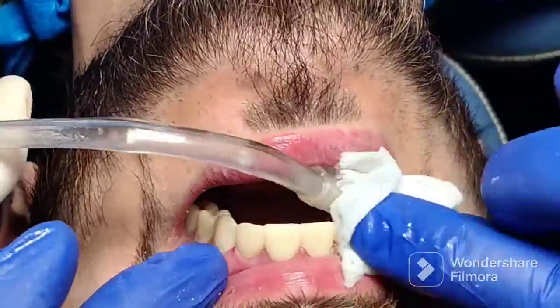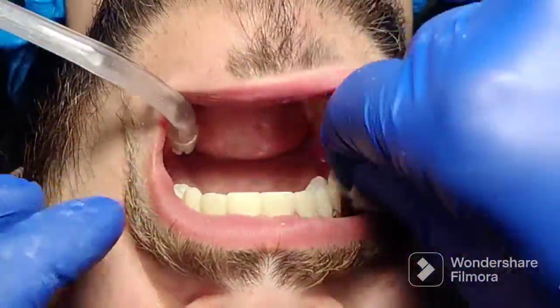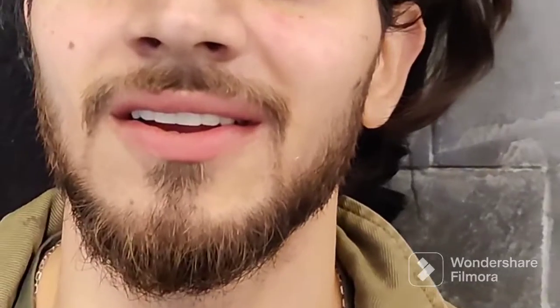Once that is done, get the patient out of the chair and evaluate the aesthetics. Any changes that need to be communicated are done at this stage, so when we do our final veneers we don't have any surprises.